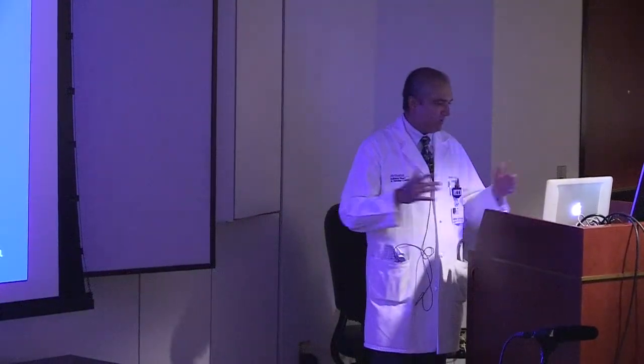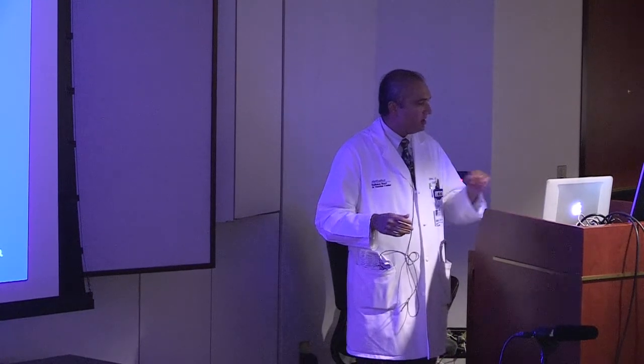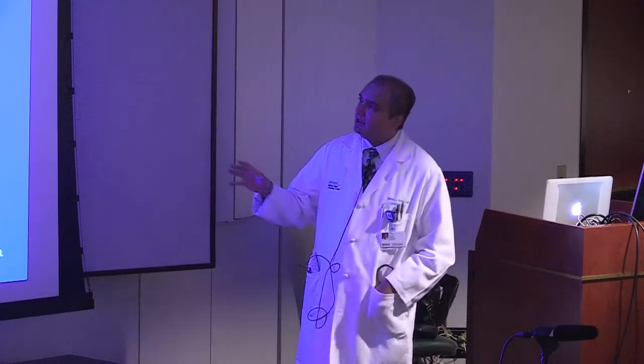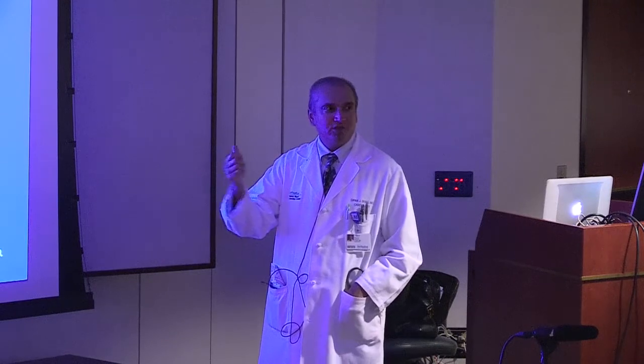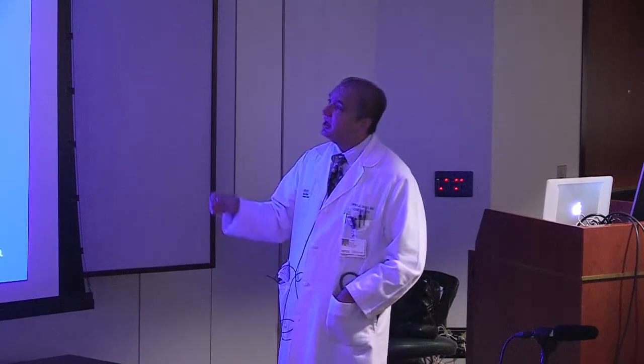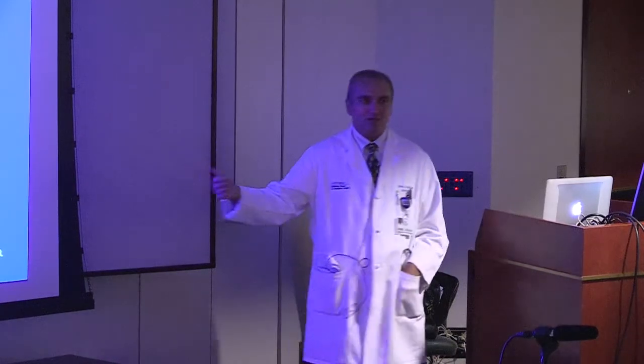And in fact, over the last 15 years or so, there's been a wealth of studies which have demonstrated that this technique can not only be useful to identify the presence of myocardial infarction, both in the acute or the chronic setting, but also can be used to identify the likelihood of improvement in contractile function.